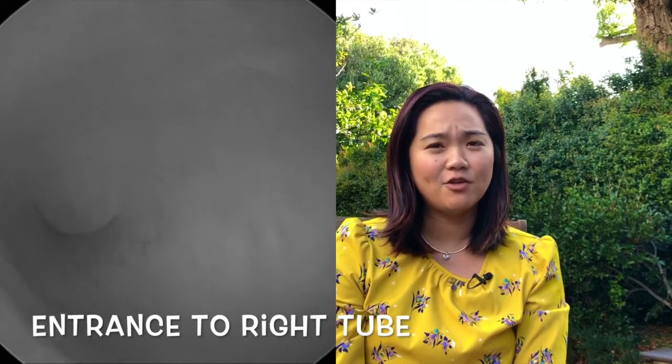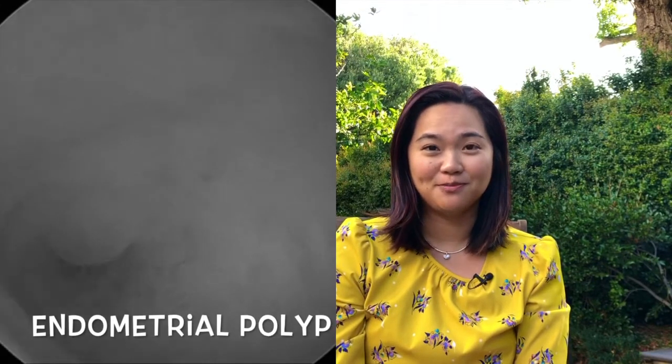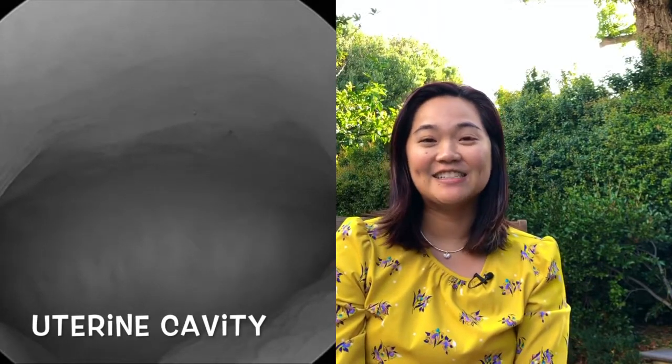And you can see there's a very small bump along the cavity, and that is a small endometrial polyp. Now we pull back to look at the rest of the cavity, and it is nice and regular. And we're coming out and you can see the cervical canal, which looks like a tunnel on the way out.